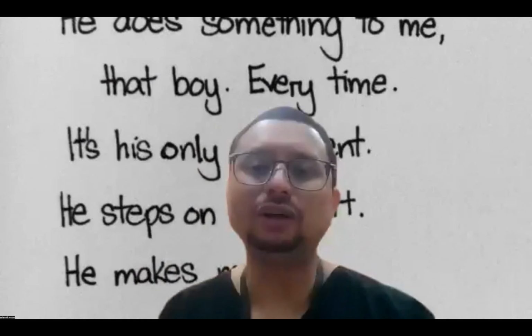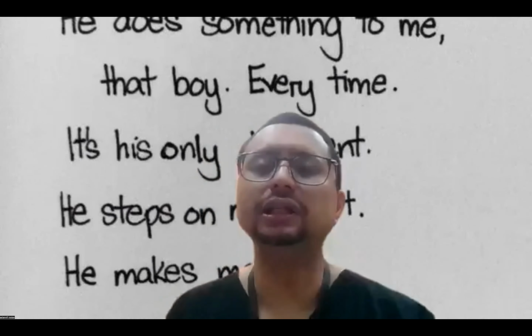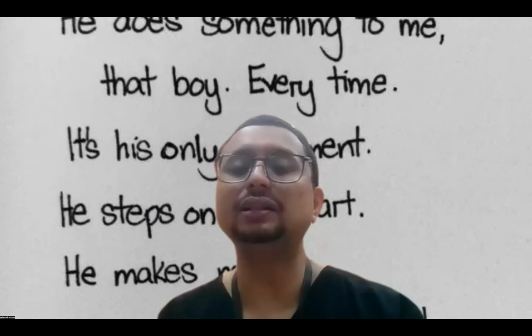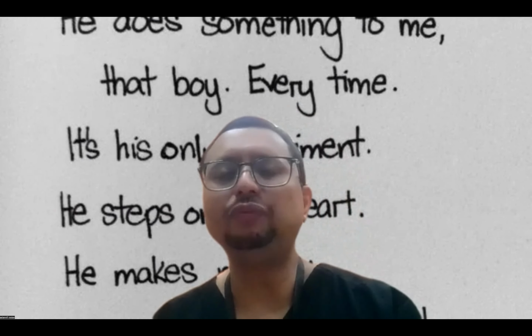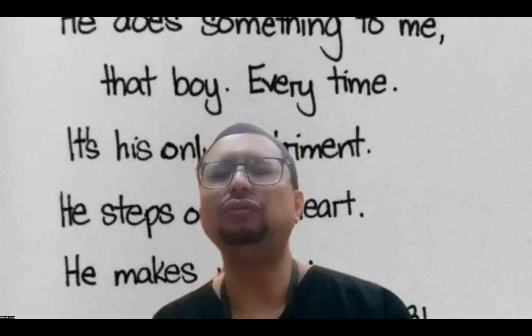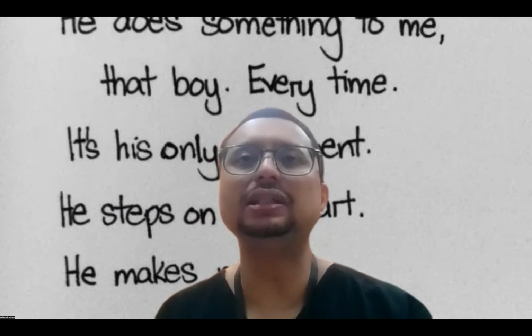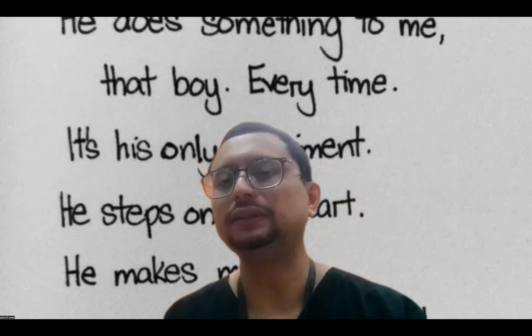And finally, now, of course, is the area of artificial intelligence. So a lot of people have incorporated artificial intelligence into the echocardiogram. To give you an example, nowadays, in order to determine the true severity of aortic stenosis, we might need to do a CT calcium score. We might need to do a low-dose dobutamine stress echocardiogram. But with artificial intelligence, by virtue of storing hundreds of thousands of patterns of aortic valve calcification, rather than needing to do all these tests, the computer can just look at the degree of calcification, and from then onwards determine the true degree of severity of aortic stenosis.